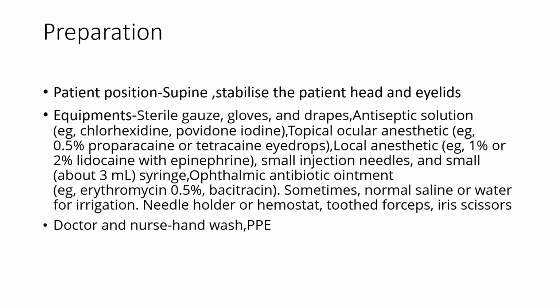Now about the preparation. We usually tell preparation of the patient, preparation of the doctor and the nurse, preparation of the equipments, preparation of the patient position. The patient should be positioned supine, and stabilize the patient's head and eyelids.